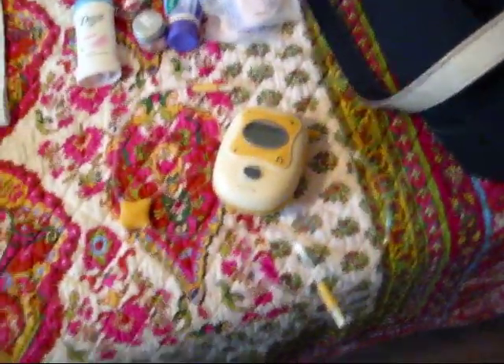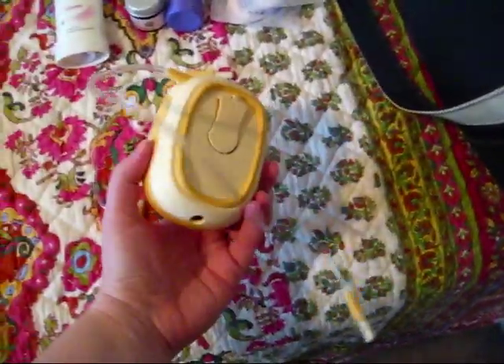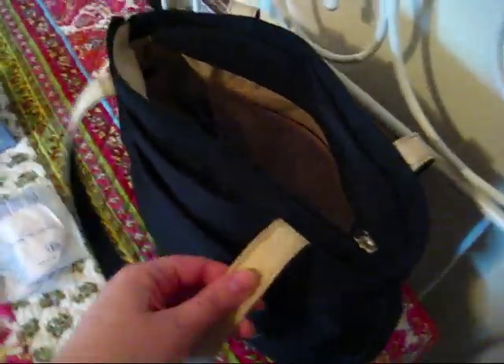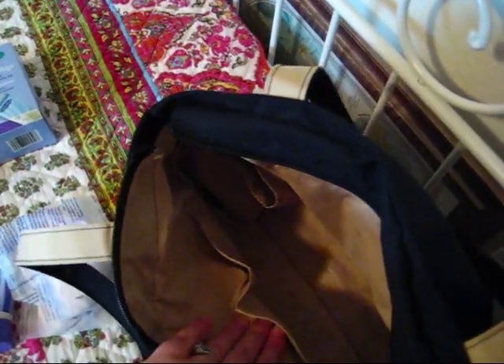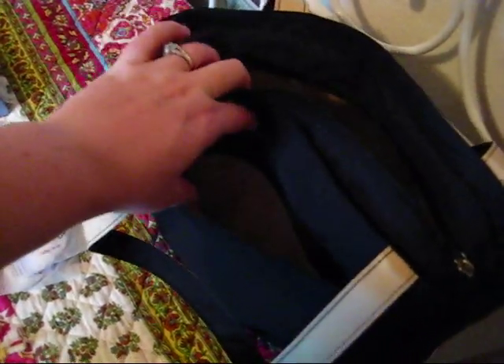My pump is a Medela Freestyle — it's the hands-free portable pump and I love it. It comes with your basic Medela bag, which is black with a cream interior. It has a zippered pocket, a Velcro pocket, a small Velcro compartment, and on the outside a little slit pocket. But the main interior is just all open.